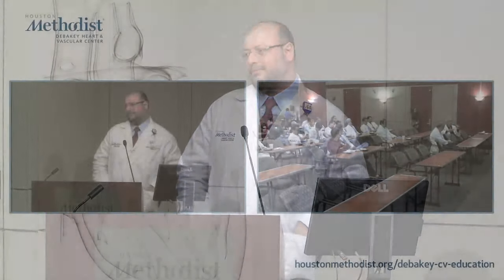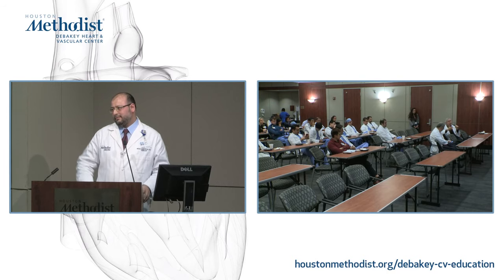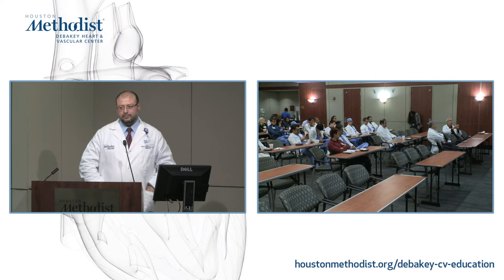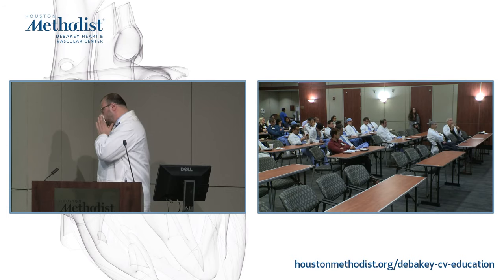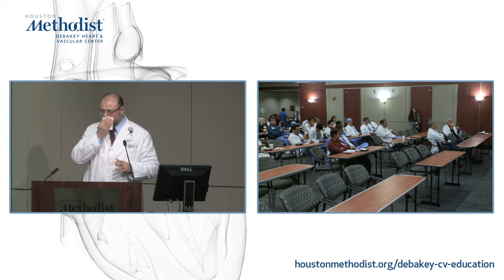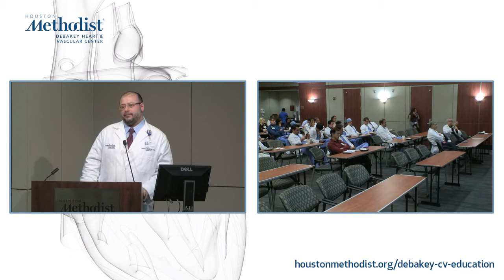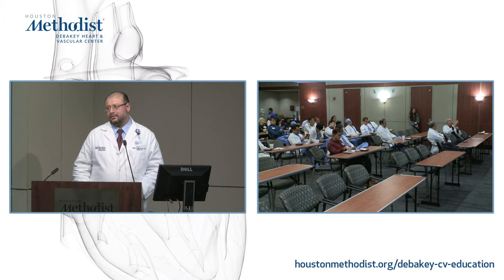Yeah, some of the issues go back to when we were talking about SPECT and high sensitivity collimators versus low, right? If you have a general purpose collimator, you're going to get a lot of potentially scattered photons into it. Even though you're getting more counts, they're not the proper counts. Whereas if you use a high resolution collimator, you get fewer counts but more spatial resolution. So with 3D, you might have a problem with spatial resolution depending on the degree to which you're picking up scattered photons.